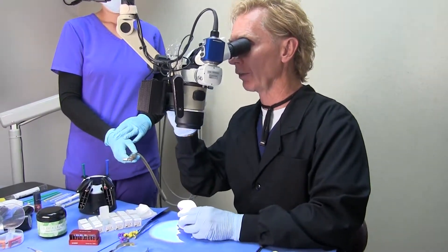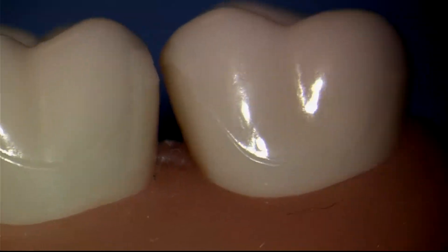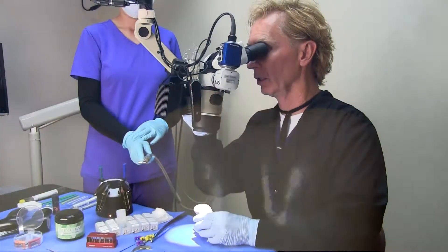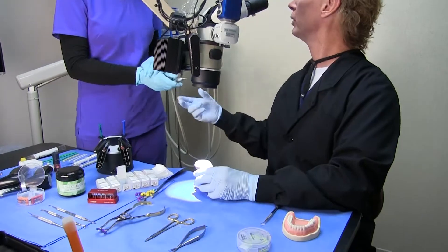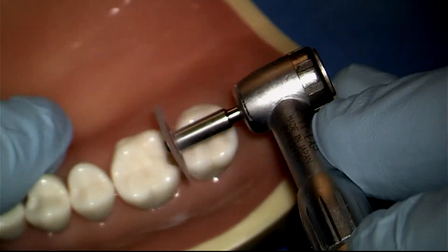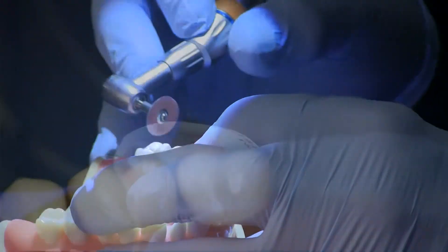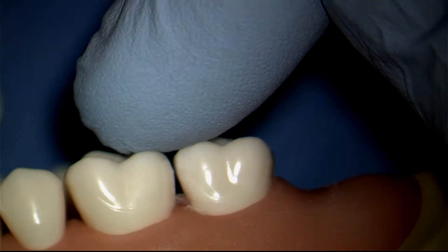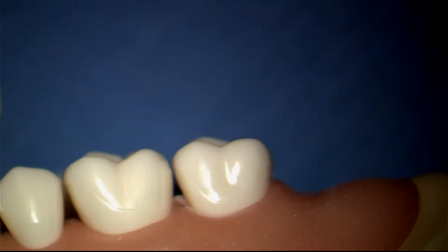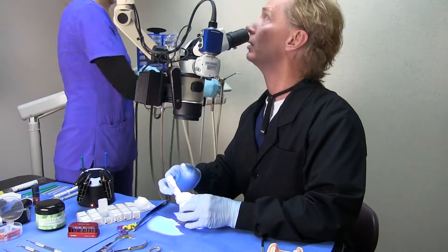The first thing to keep in mind is that a lot of naturally occurring contacts are what we call a kissy contact. You'll notice in this particular case that the contact is really too high on the occlusal, and a lot of contacts are naturally not very smooth. So what we like to do is take a disc and flatten and smooth the neighboring tooth. Now we have flattened the contact — there's a much larger contact, it's no longer invading the space of the neighboring tooth, which often happens when we have a little bit of crowding. That contact is now going to be much better and much more in the middle of the tooth.